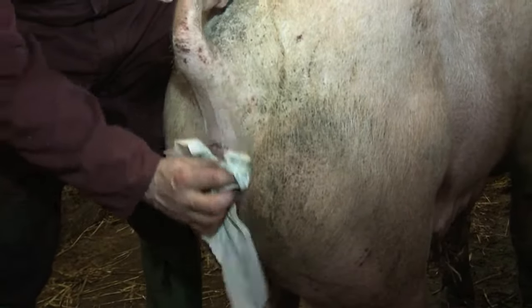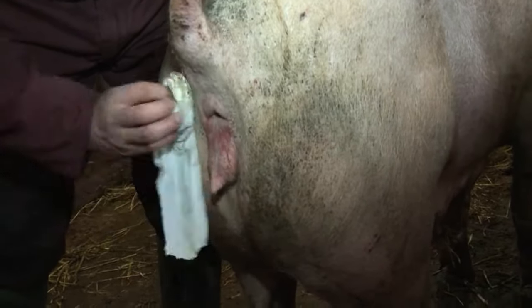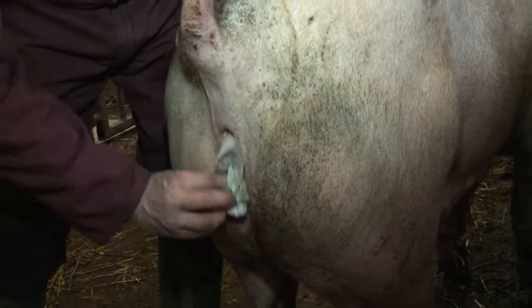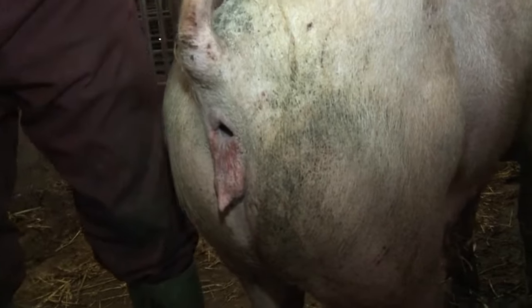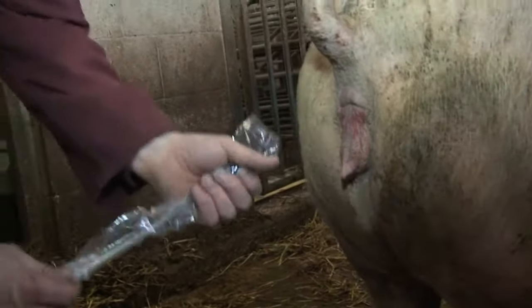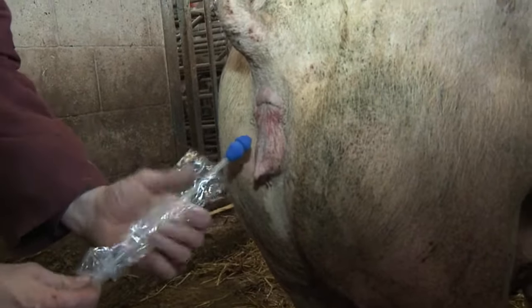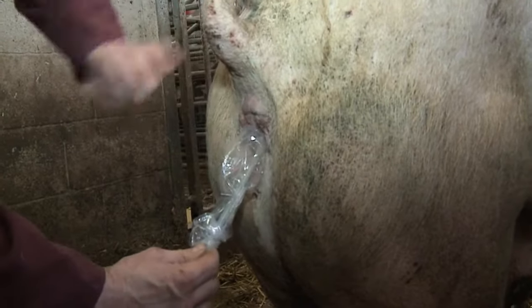Clean the vulva with dry paper toweling or use special non-spermicidal wipes, being careful not to push dirt into the vulva. Ensure hands are clean before handling AI equipment. Don't touch any part of the catheter before it has been inserted. Open the vulva outwards so that the head of the catheter has a clean entry.